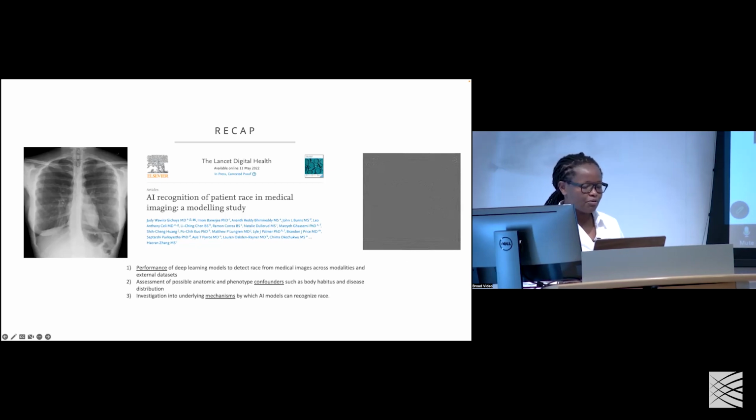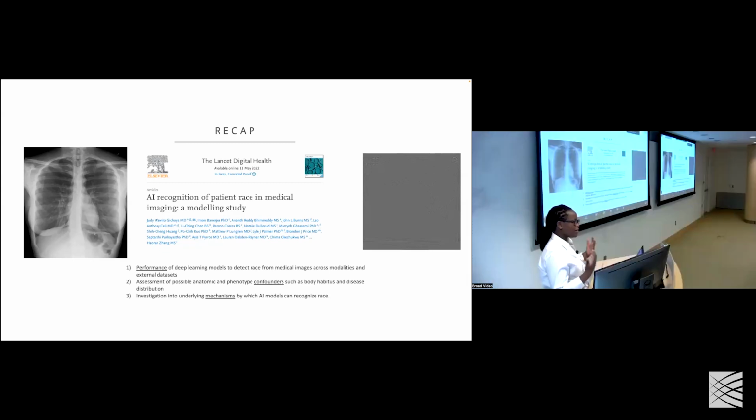And again, one of the bigger things that made me start to move toward this hidden signal is, for example, applying a high-pass filter to the chest X-ray and still having the same performance. So this has shifted my work to a little bit of, not defensive, but trying to validate other people's work.